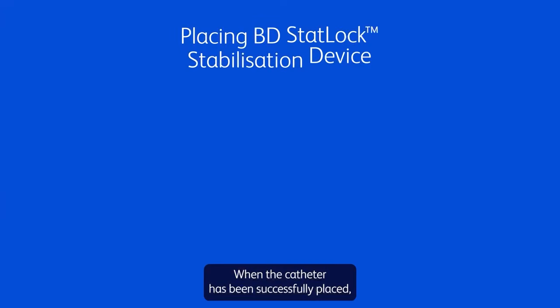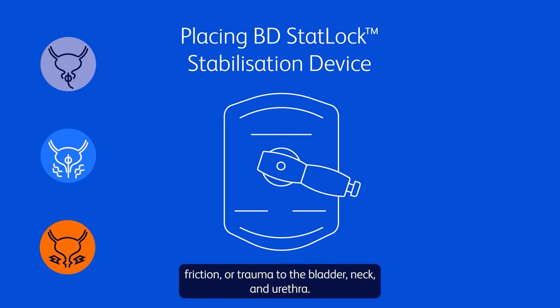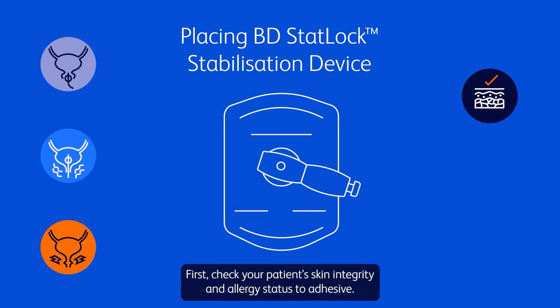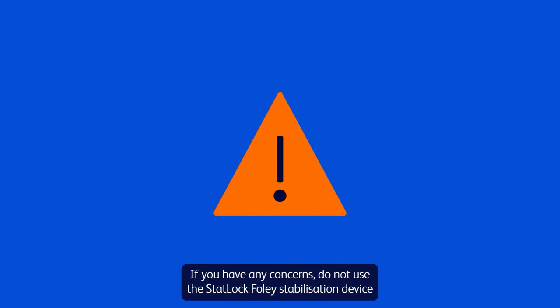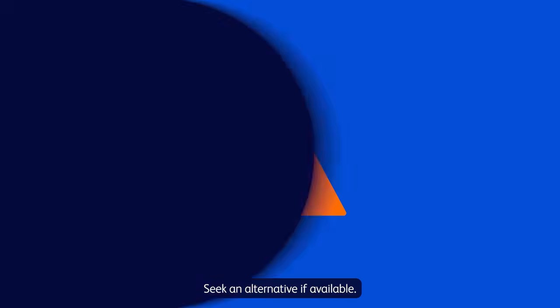When the catheter has been successfully placed, you need to secure the catheter to prevent unwanted displacement, friction, or trauma to the bladder neck and urethra. First, check your patient's skin integrity and allergy status to adhesive. If you have any concerns, do not use the StatLock Foley stabilization device that is contained in the tray and document the reasons why. Seek an alternative if available.